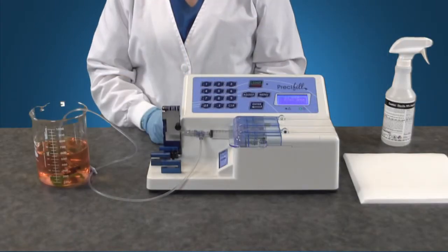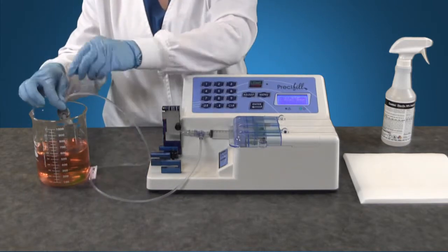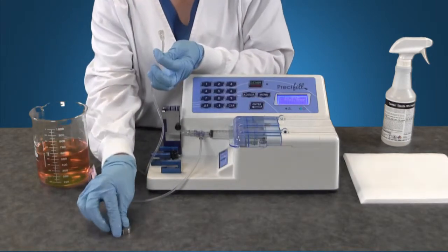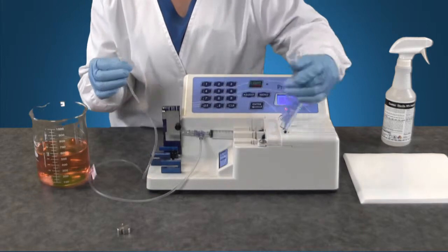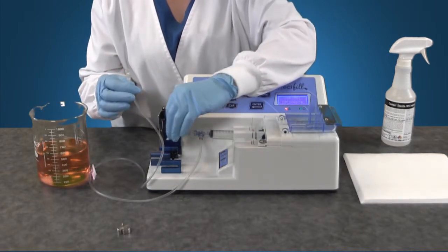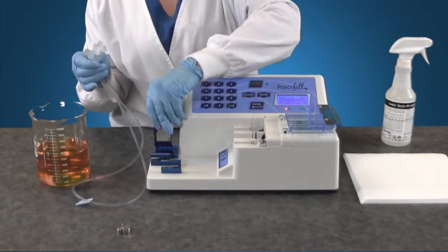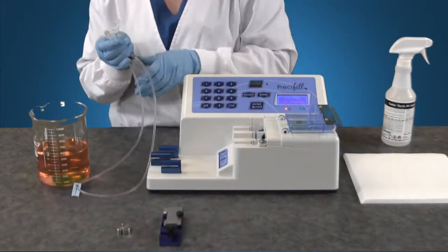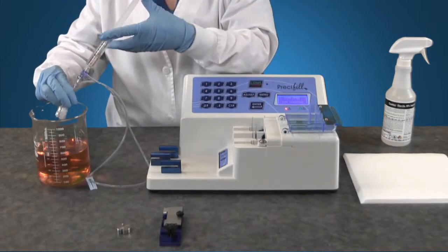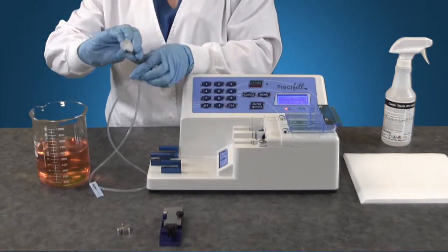Once you finish your batch remove the tubing set end from the solution container and remove the anchor. Remove the master lure lock syringe from the port and the tubing set from the block holder. Draw back on the syringe plunger and remove all solution from the tubing set back into the solution container.